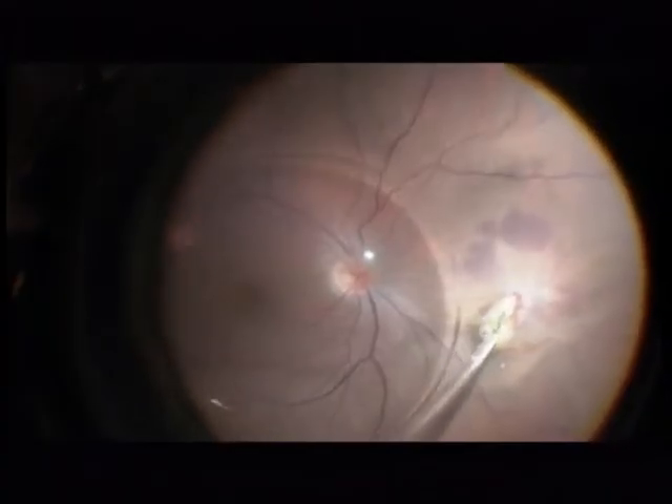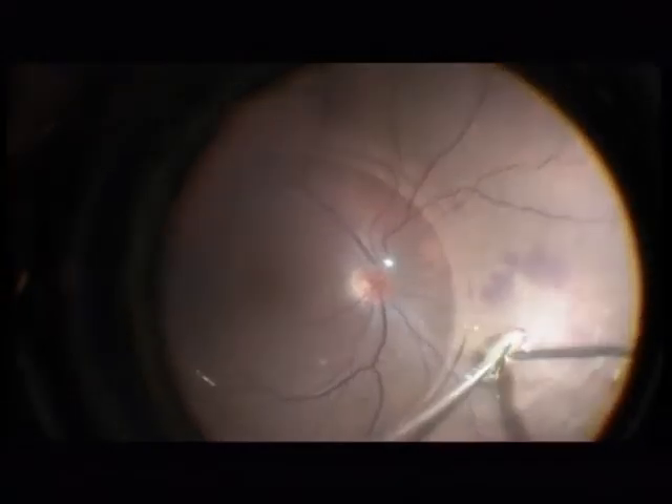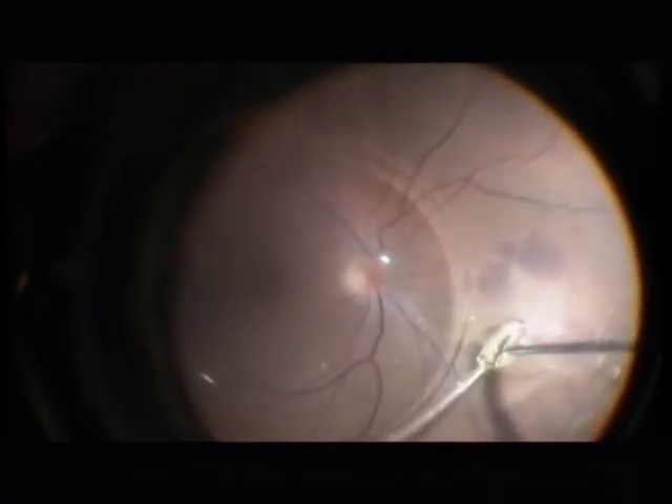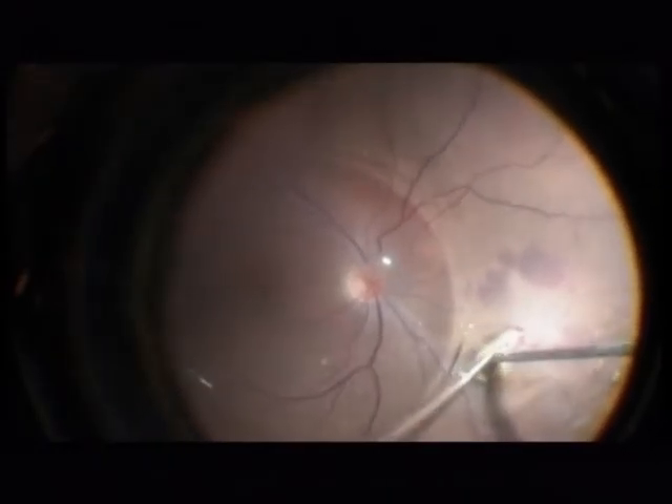It could be an alternative to leave the foreign body in place, but as we know, metal causes toxic retinal damage after a long time. So I am continuing to remove it. Now I am using an Atkinson cannula and a forceps.